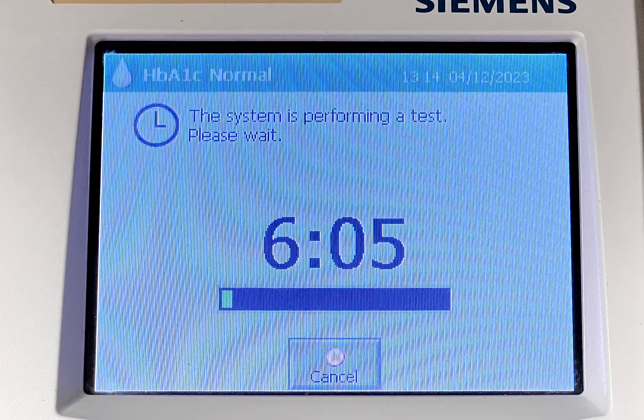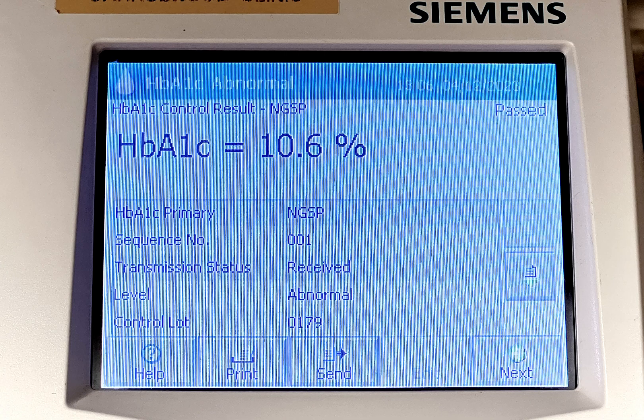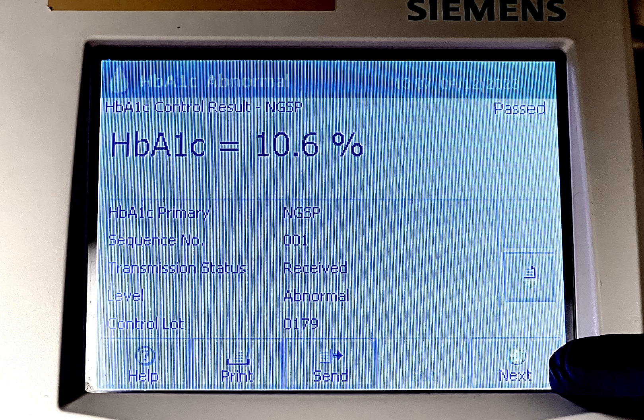The test will take about 6 minutes to result and pass. The abnormal result will show when the test passes. Click next.